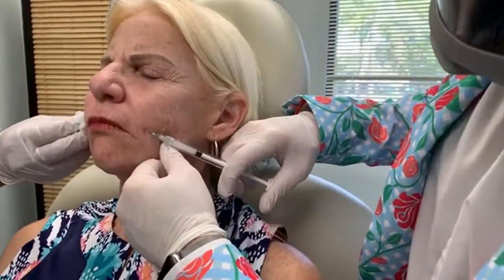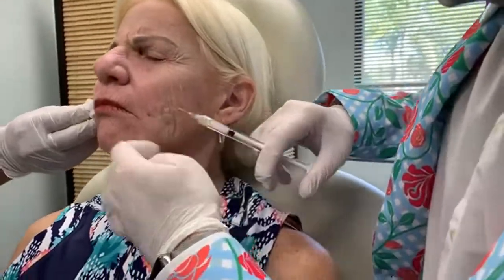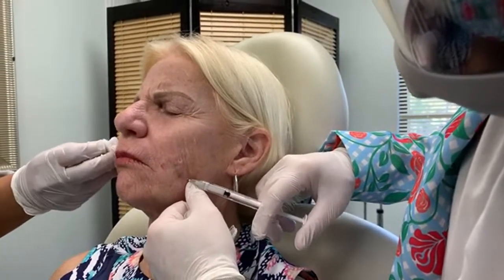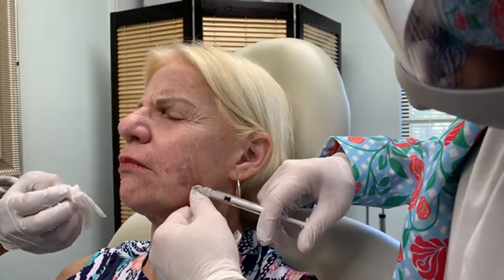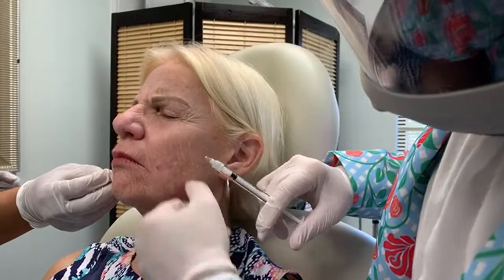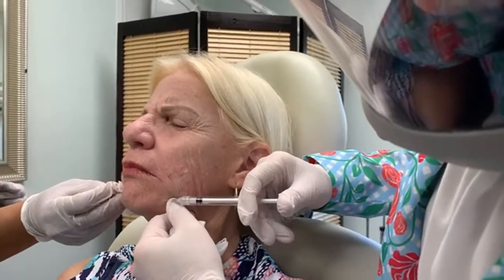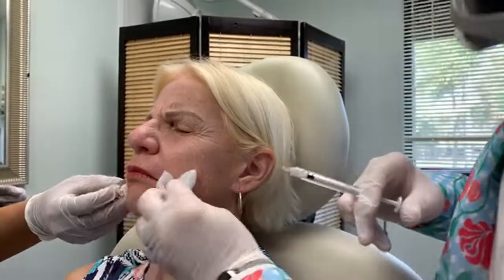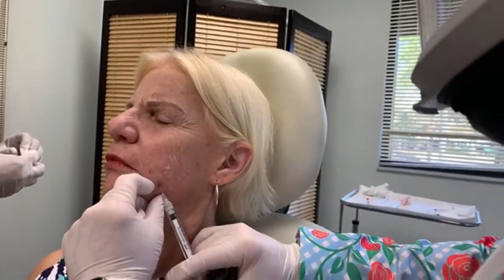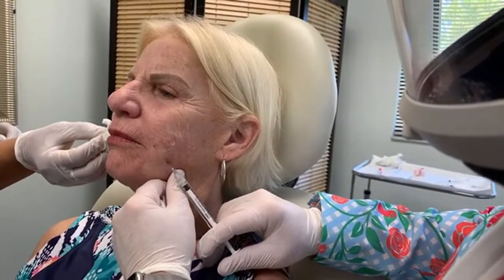Pressure pinch. Little pinch. Little pinch. Every little bit helps because we lose that volume and that collagen. How you doing, Donna? Good. She's tough. Great. We try and make it easier than the dentist's office.